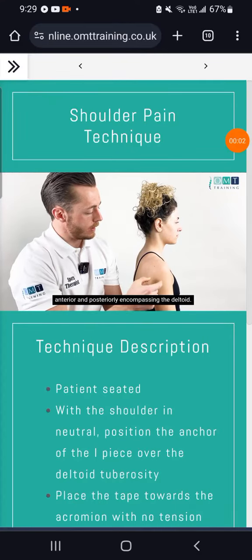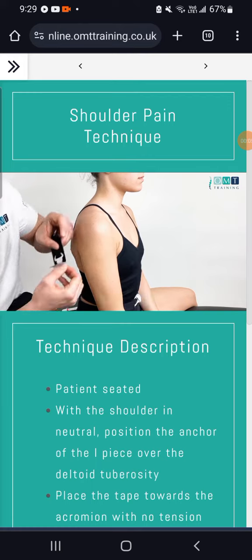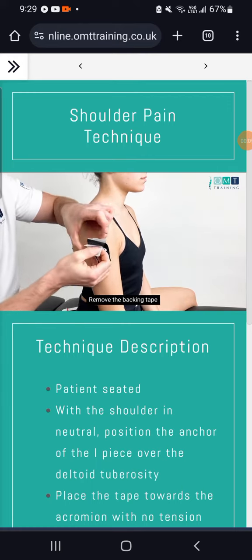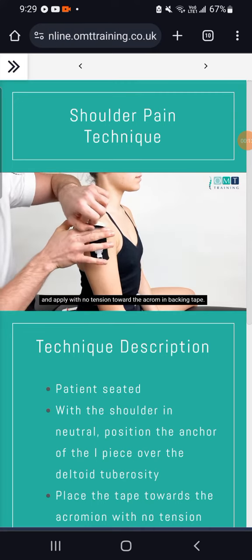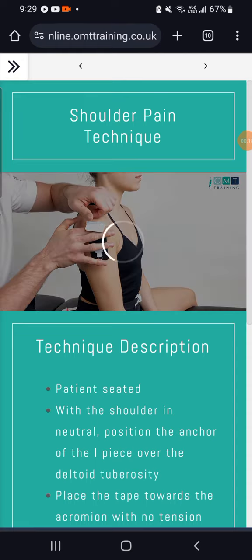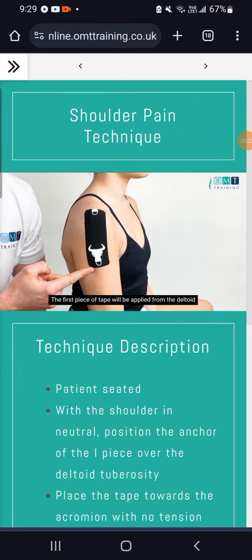Anterior and posteriorly encompassing the deltoid. With our first piece, apply the anchor over the deltoid tuberosity. Remove the backing tape and apply with no tension toward the acromion. The tape will be applied from the deltoid tuberosity up toward the acromion with no tension.